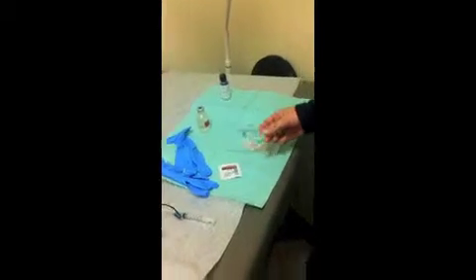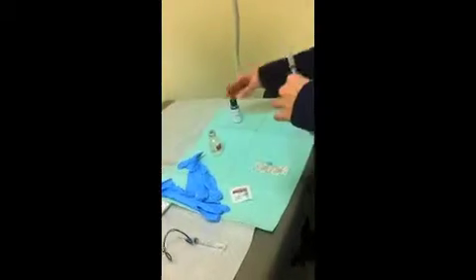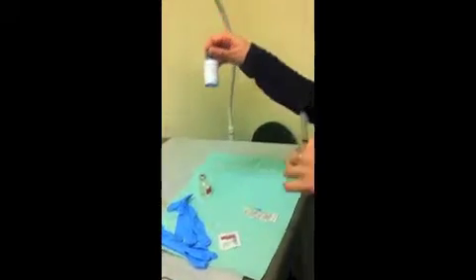We have a Band-Aid for after the procedure itself. We have a 2 to 3 ml syringe with a current 18 gauge needle that we'll use to draw up our solution, which is the 1% lidocaine without epinephrine. We'll draw up approximately 1 milliliter of this.